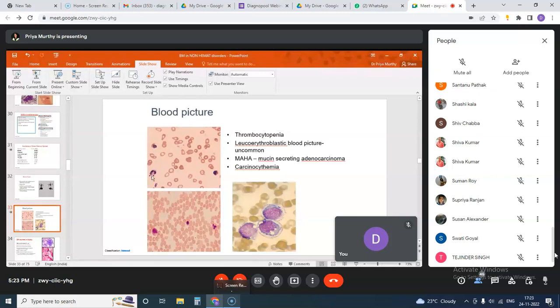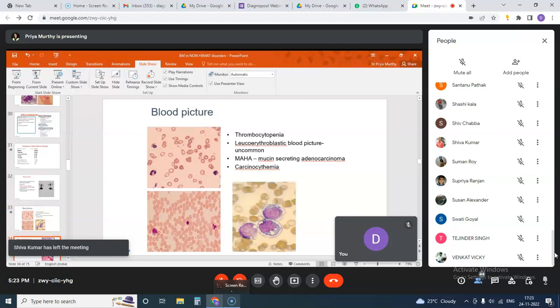Here what we see are neutrophils, some myeloid precursors and nucleated red cells, and this could give you a clue that the bone marrow is irritated because of something, either because of fibrosis or because of a foreign cell within the bone marrow, and that is why there is a leukoerythroblastic blood picture. And rarely we come across circulating tumor cells within the peripheral blood.